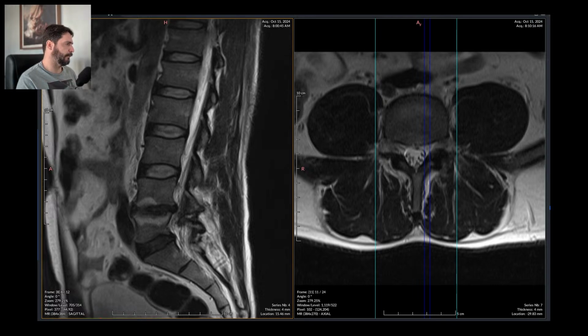Let's see if we have a brain CT or MRI here so we can change a bit. Now it's slowing down. Come on. So the platform is slowing down. We are 52 minutes in, and it seems it's all fine and dandy.